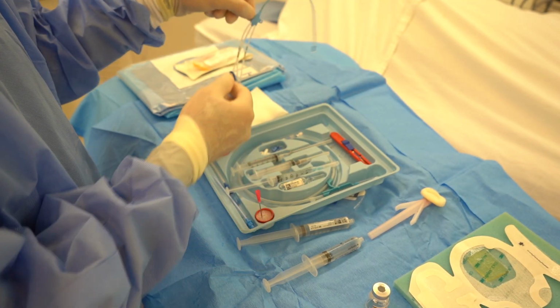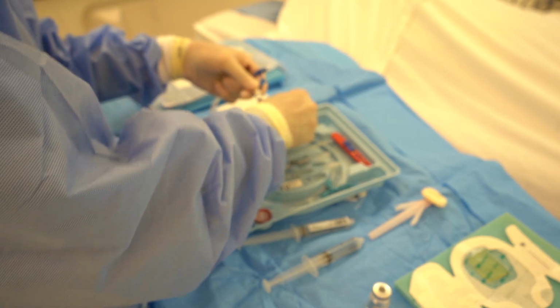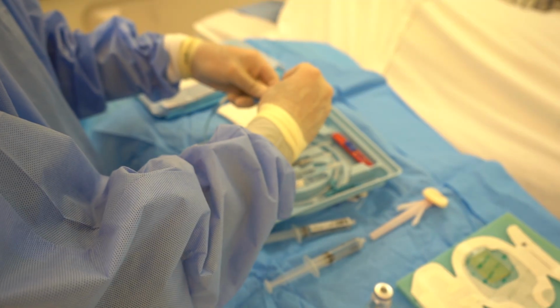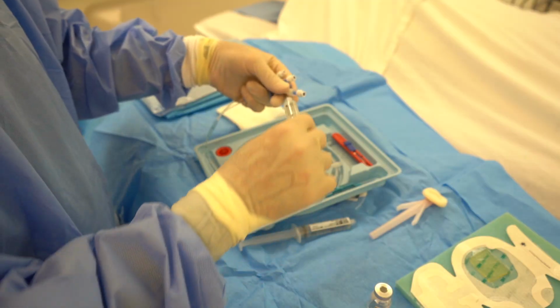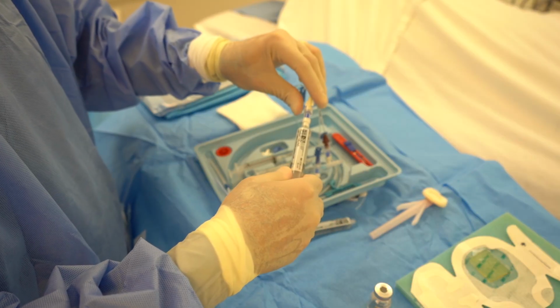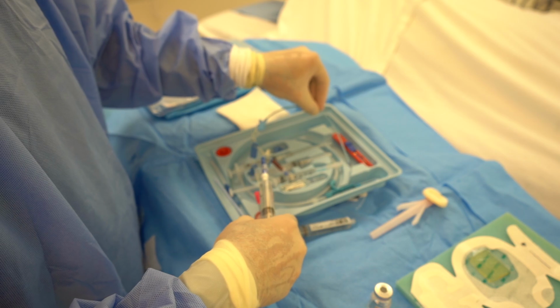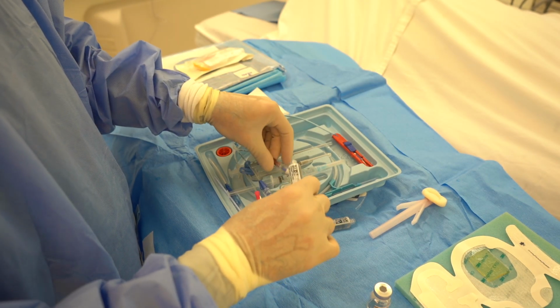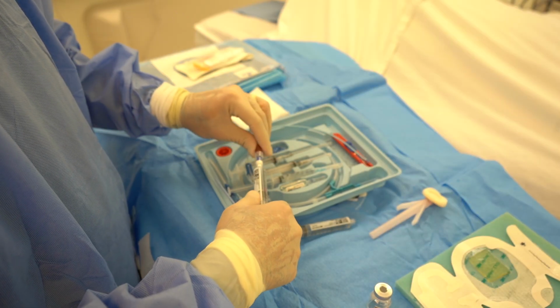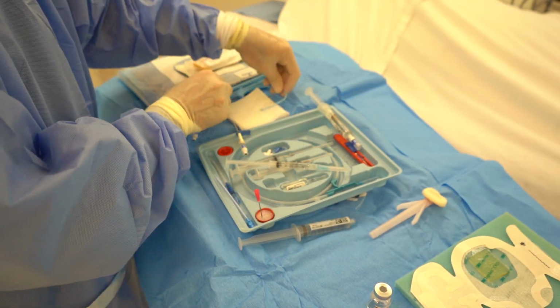We're going to grab our triple lumen catheter. In this case, we have a 7 French 20 centimeter catheter. We're going to place our Luer lock caps on the catheter, and you can see here I'm doing all 3 of those. We're going to flush those with saline, starting with our lateral ports, and they take less than a cc each. And we'll finish with our central port, our distal port here. Flush that, and at the completion of this, we'll actually take the Luer lock off with the syringe so that it is ready for once the line is in place.